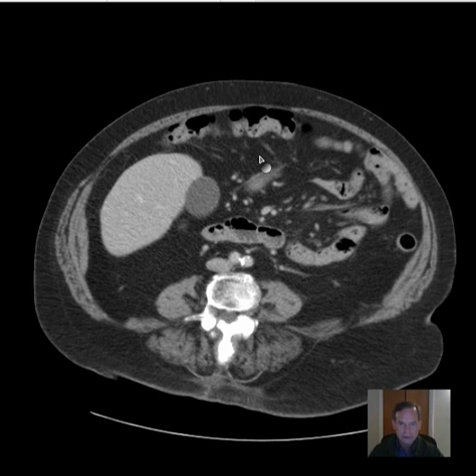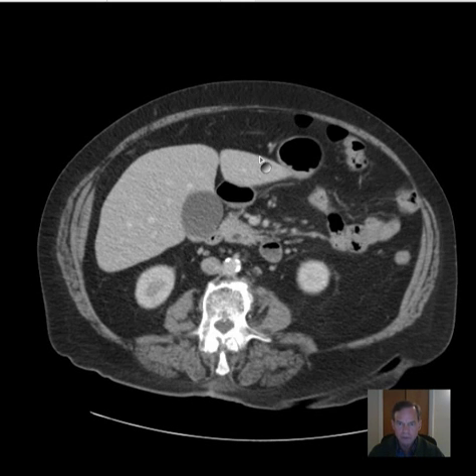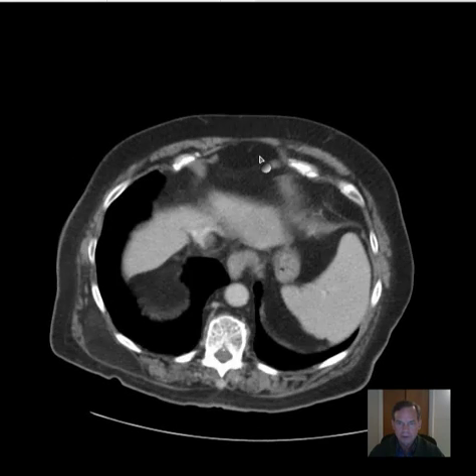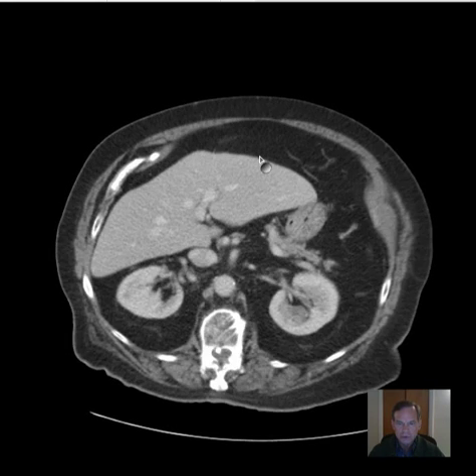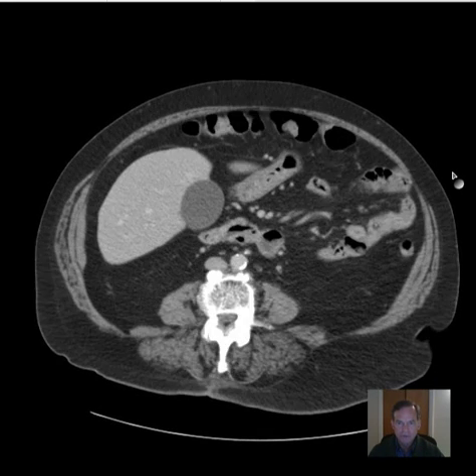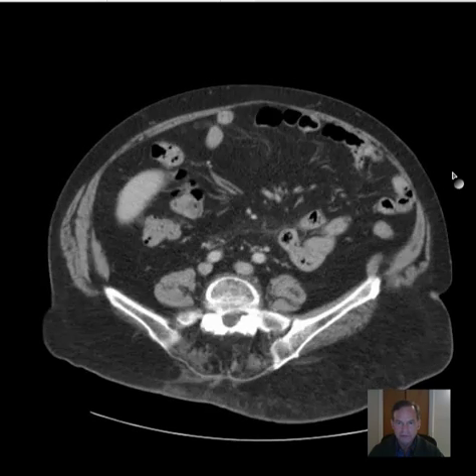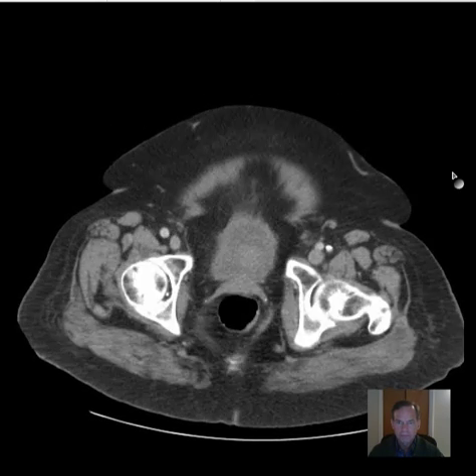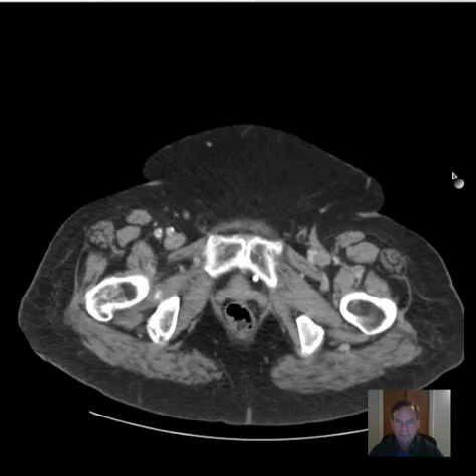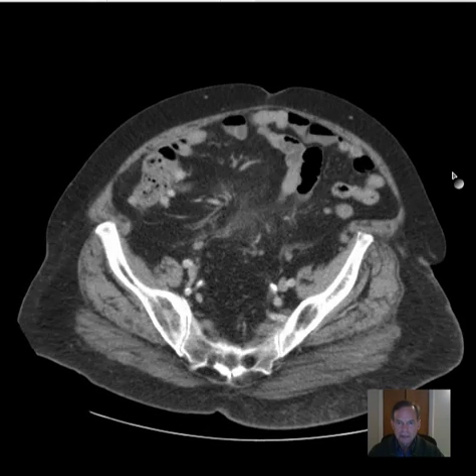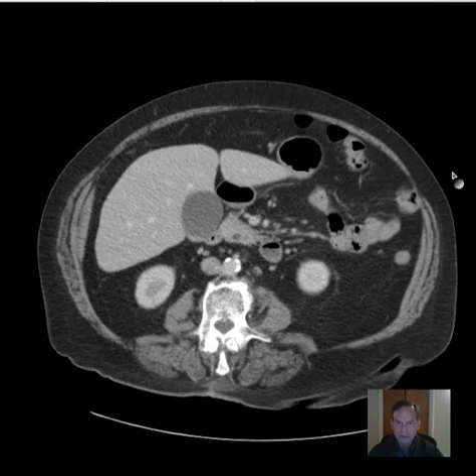Hello, this is Dr. Mintz. This is a patient that presented with abdominal pain and fever. We can scroll through the axial images just to give you an overview of what we have here, and now let's go through what we have to make sure we evaluate.